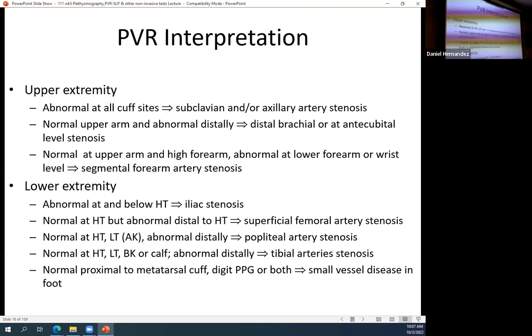With MSK, they just looked at the cartilage. But in between, you could tell, because it's still a transducer. They didn't use a hockey stick, actually. She used a linear one. Okay, that makes sense. It was in between his bones, obviously, but you could tell it was coming off of a vessel. It looked like a cyst. A pseudoaneurysm full of blood? No, that's the thing, there was no blood flow. She put color on it. A tumor then? Probably, that's what she said.